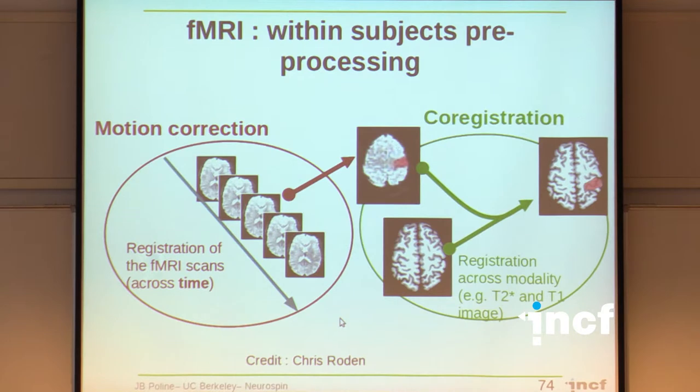So how do you process that? The fMRI acquisition is just a brain volume every 2 or 3 seconds. The volume is acquired quite quickly for an MRI machine, with a resolution of, let's say, 3 millimeter cubes. It's a great number of neurons in one voxel.